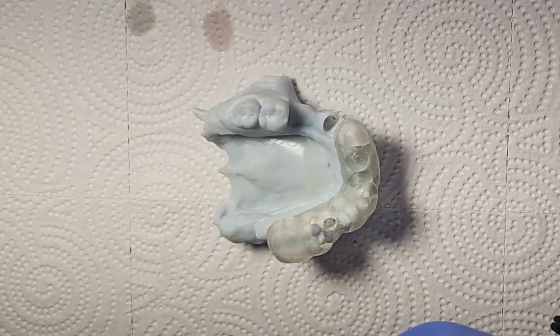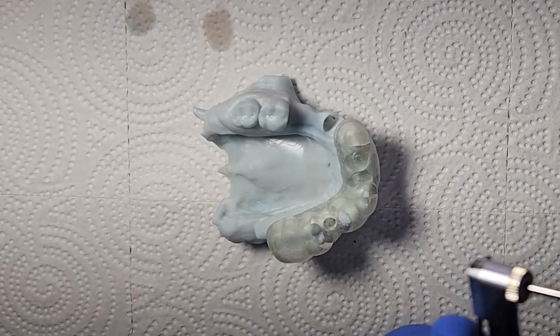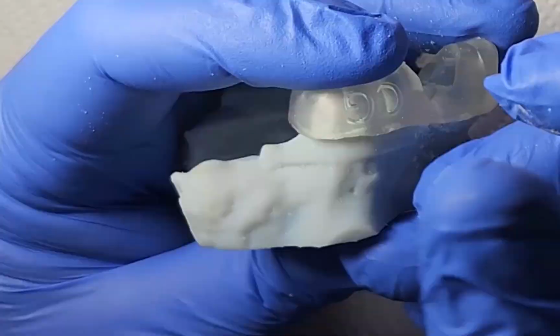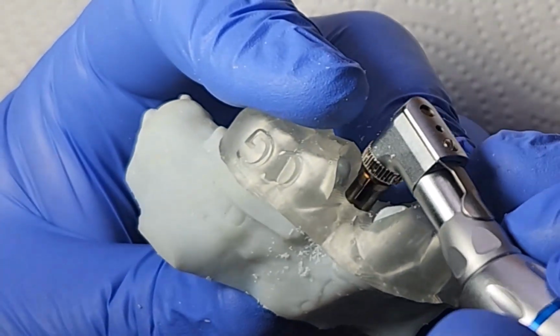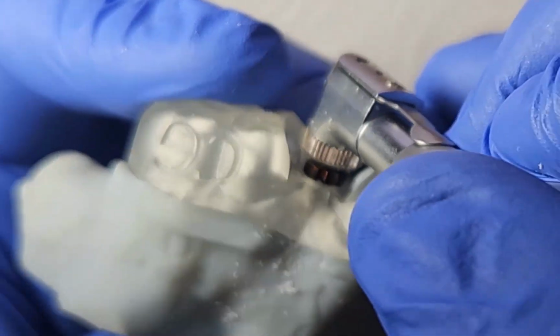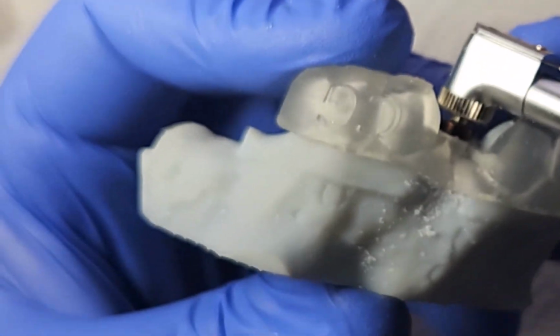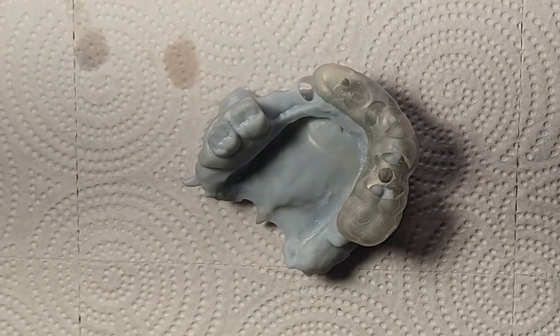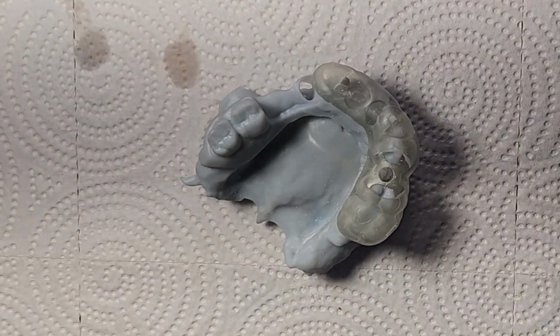This is going to profile about a 5mm diameter. And so now I'd be willing to bet you that going back with this same drill, you would see that it does go all the way to seat. And sure enough, it does. All right, you can see that the drill is completely indexed. So that's 2x6. Remember, we're placing a 4.3 by 10mm implant.